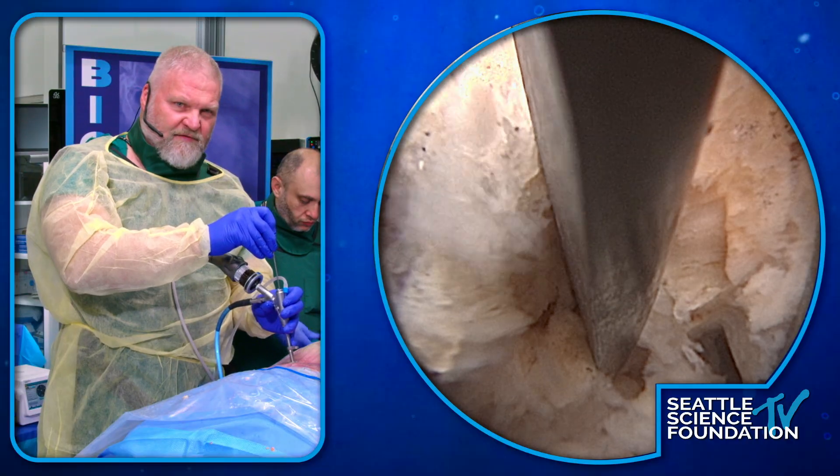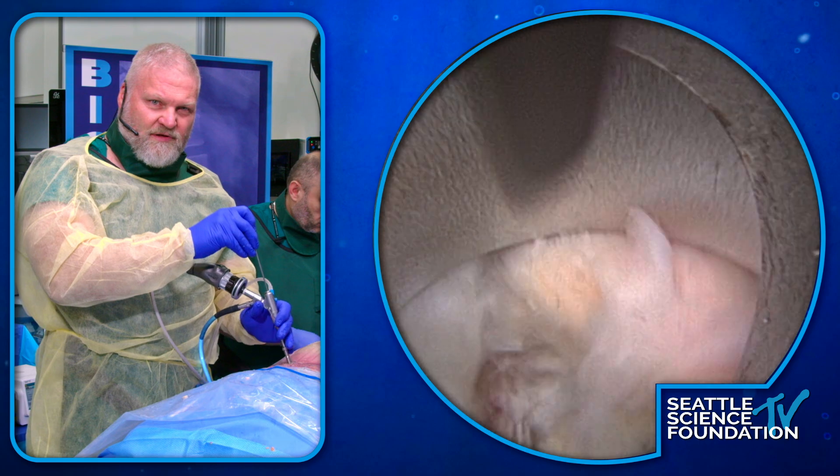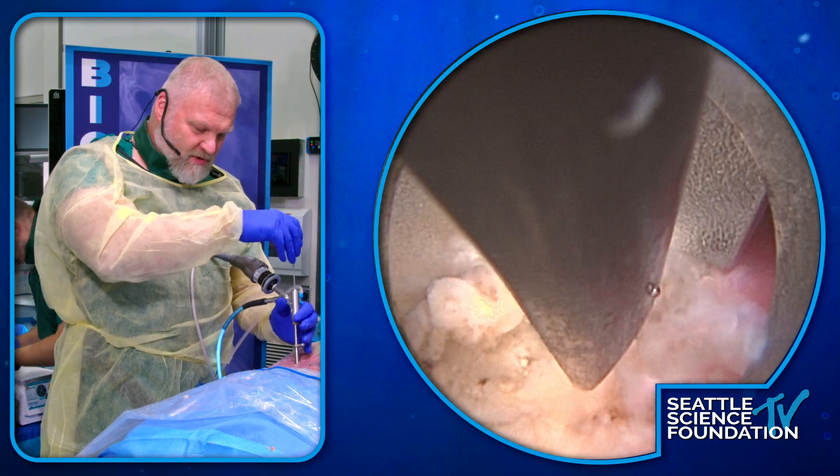Here's some soft stuff — ligament, ligament, bone. So this is the leading edge of the lamina here. We're on the left side. What we really like to do is go up to the caudal edge of the other lamina, but the remnant is still here and totally in the way.